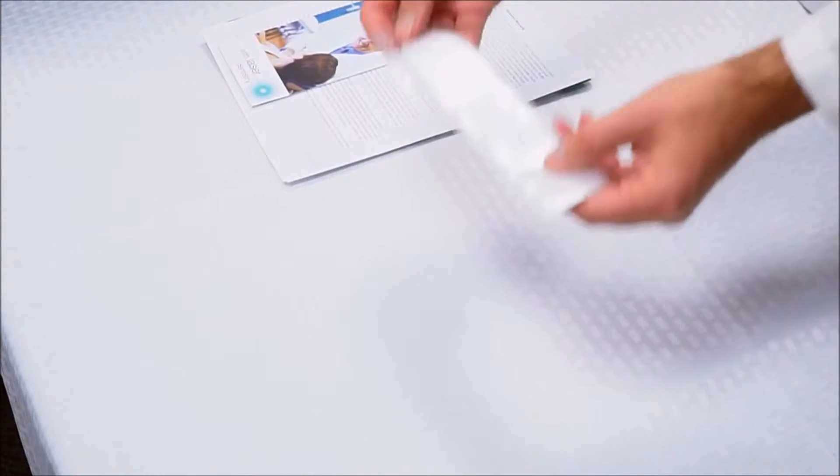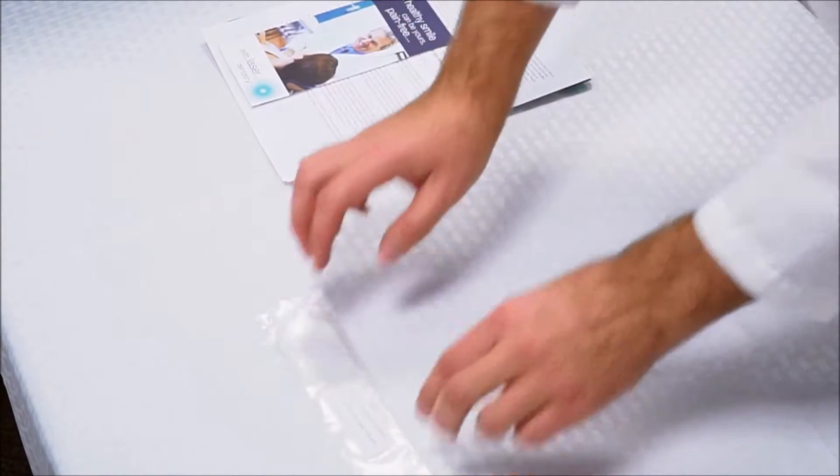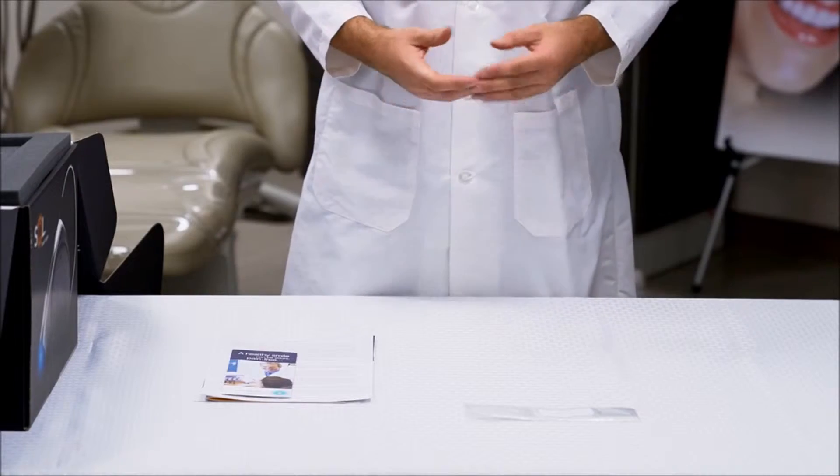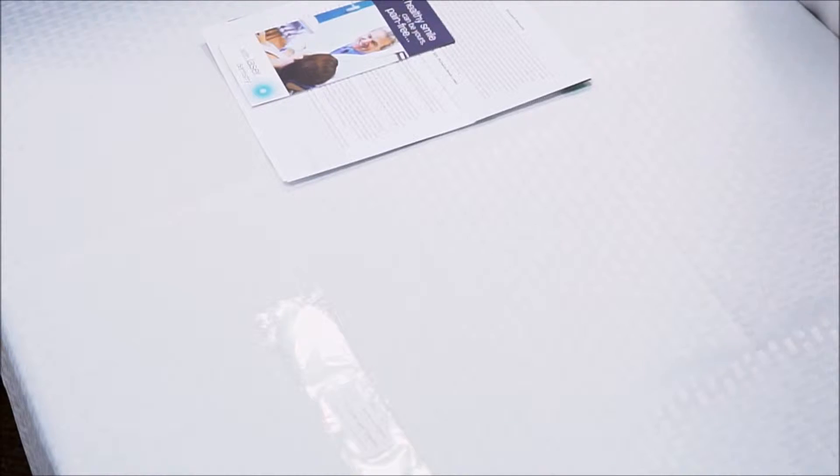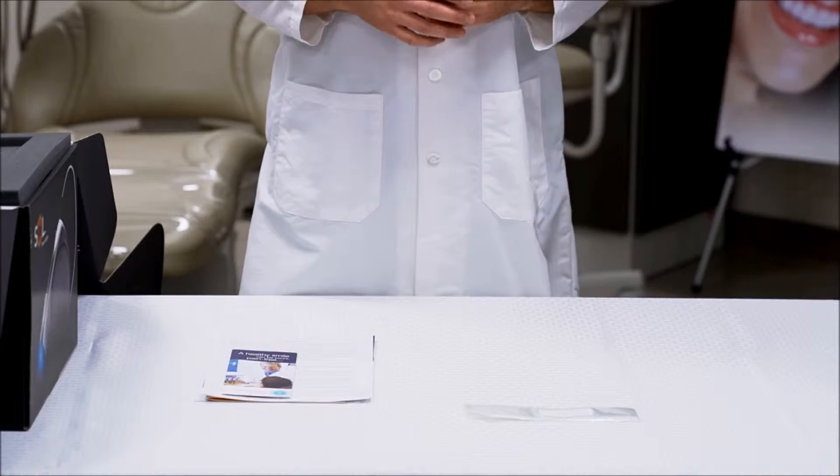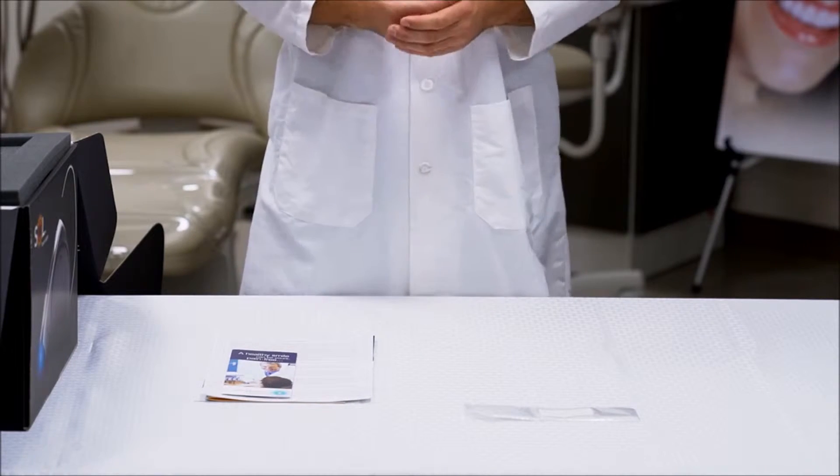The first thing you'll see in here are 25 disposable laser sheets. These laser sheets can be used to cover the Sol handpiece so that after every procedure you can throw them away and you don't have to worry about additional disinfecting.